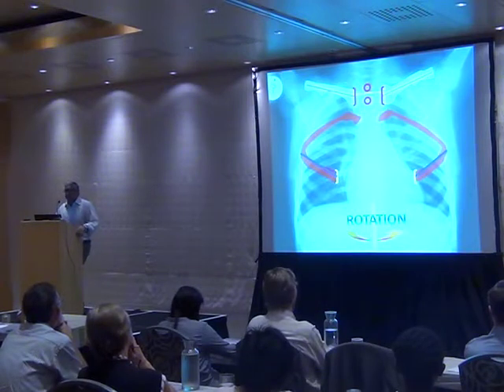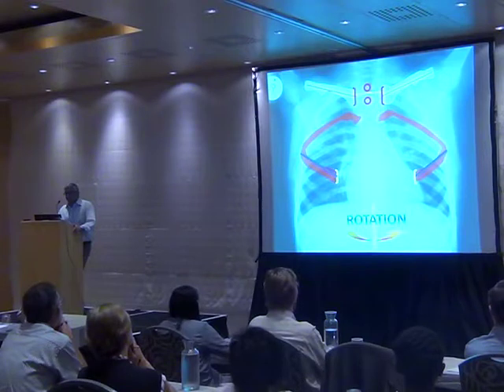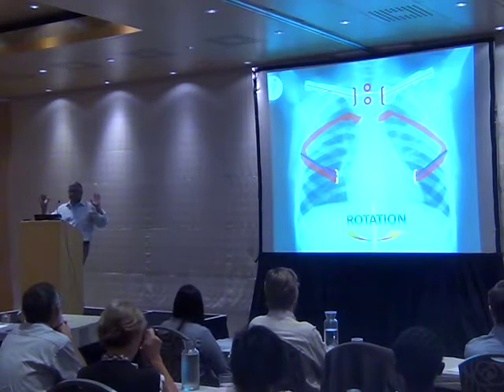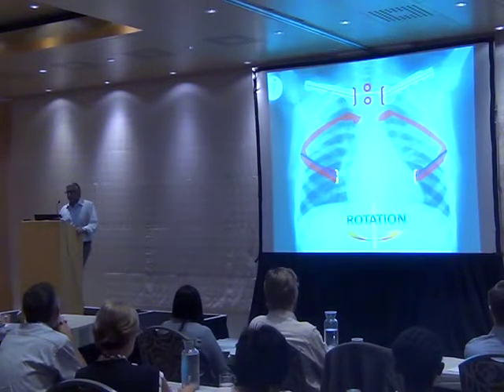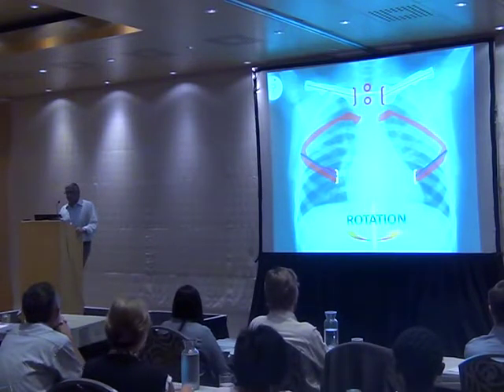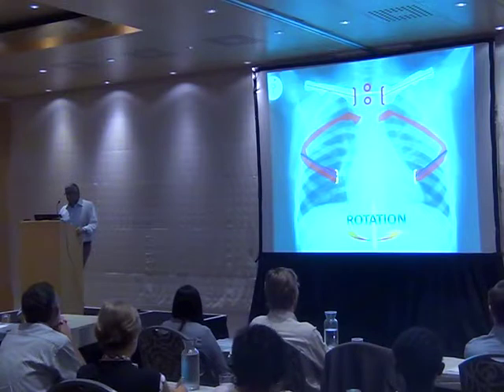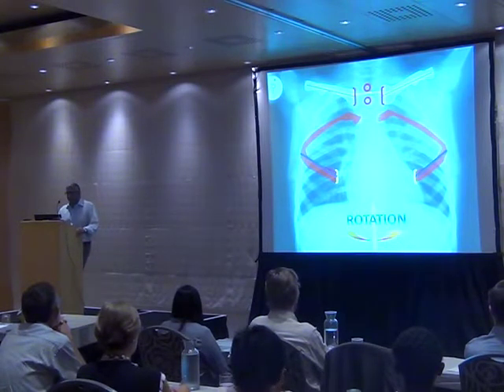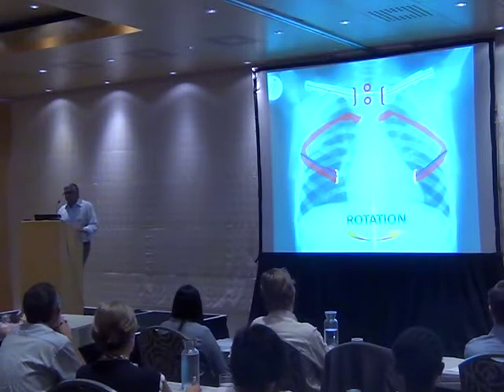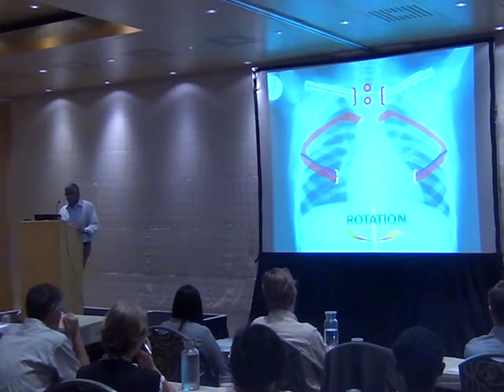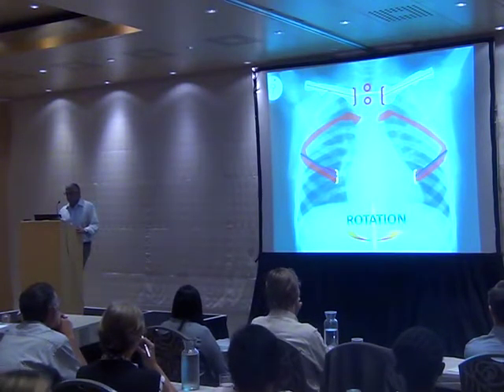Rotation probably represents the greatest challenge in a child who is often throwing themselves back and turning side to side. In adults, we evaluate rotation in terms of the position of the spinous process relative to the clavicles. We can use this in older children, but in younger children we prefer to use the length of the anterior ribs. This applies to rotation in a vertical axis — what we like to see is that the anterior rib ends should be at least equidistant. Rotation to either side may simulate pathology within the hilum of the lungs in particular, and alter the configuration of the heart.